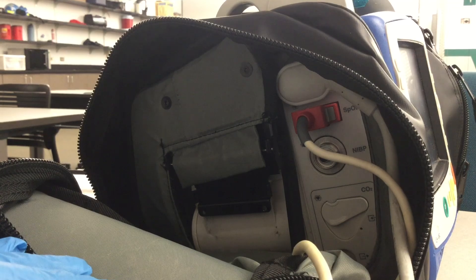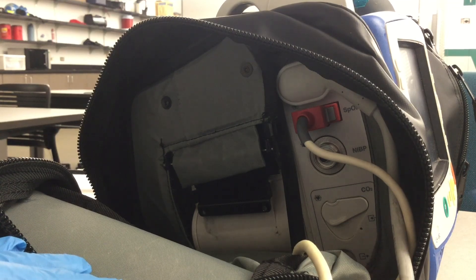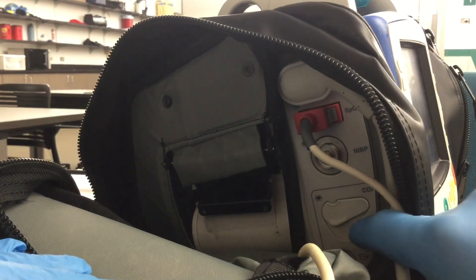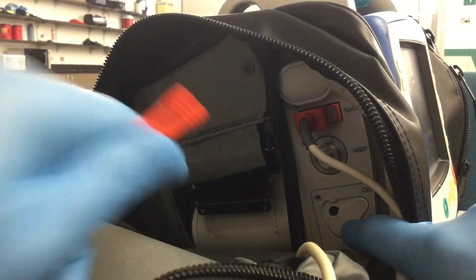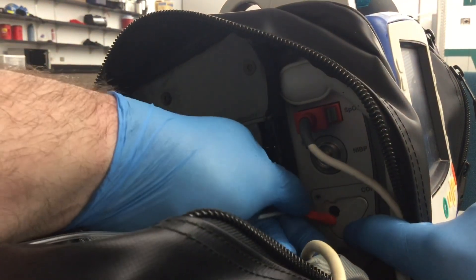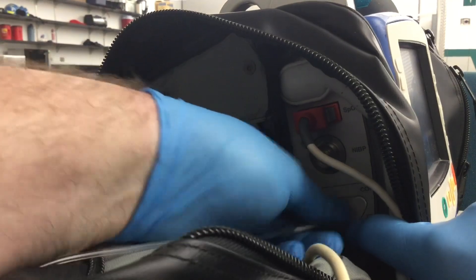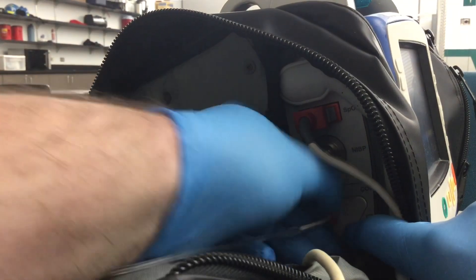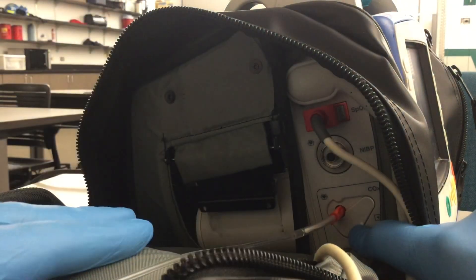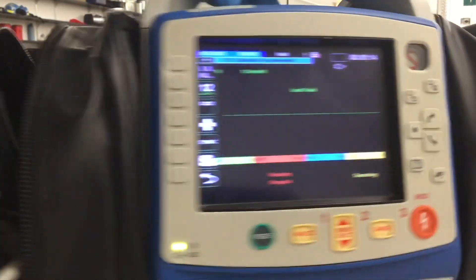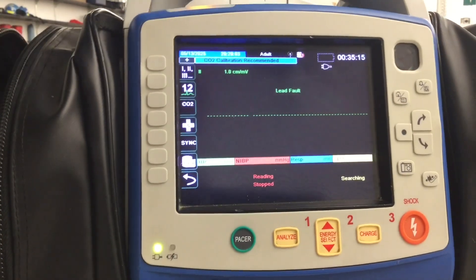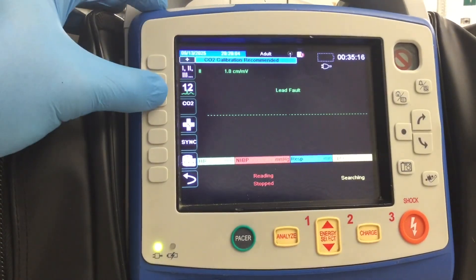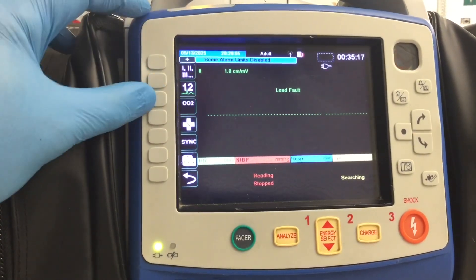On the Zoll X-Series monitor, the CO2 line is inserted in the side. Pull down the safety cover and insert the line, twisting it gently clockwise until it seats against the monitor. Don't be too rough or it may break off in the monitor. Then on your home screen, press the soft key button next to CO2.